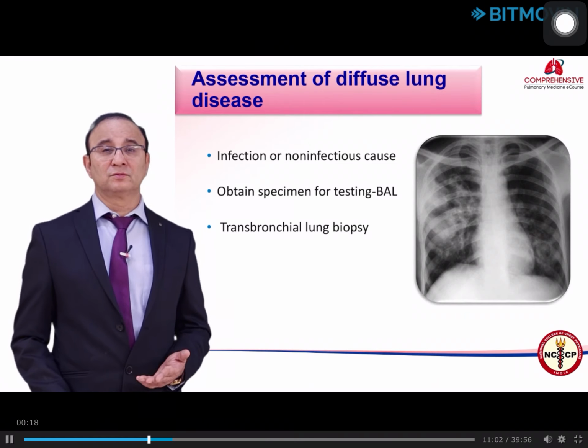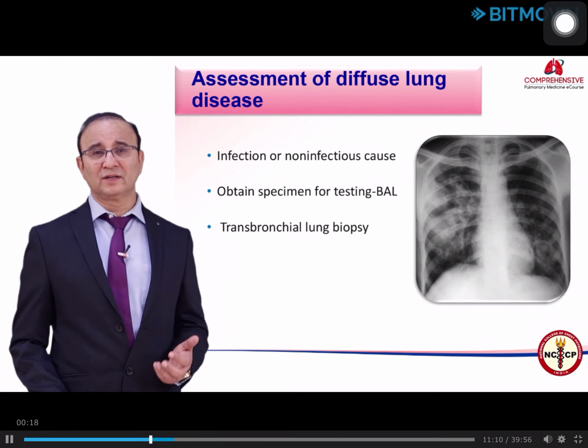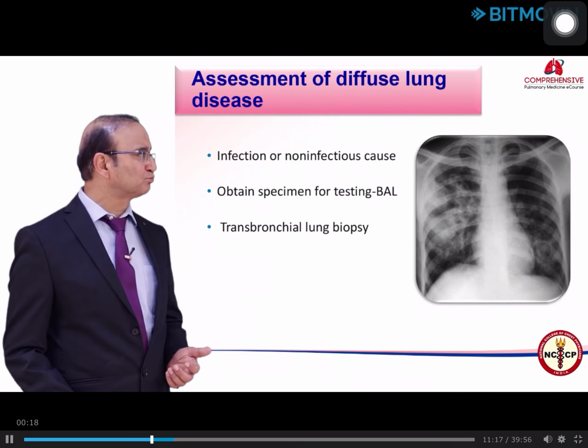It can help you diagnose a lot of diseases like sarcoidosis, malignancy, lymphangitic carcinomatosis, and eosinophilic pneumonia. The transbronchial biopsy is useful in many of the patients who have diffuse lung diseases.